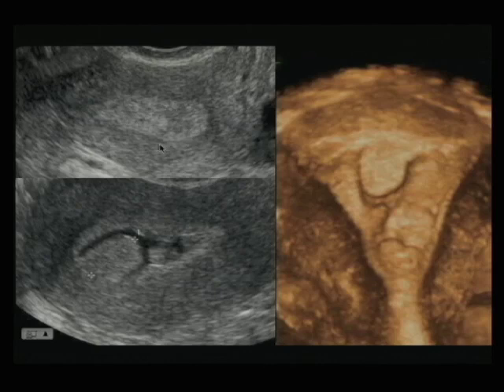So we really do need to introduce a little bit of fluid. The endometrium is definitely irregular here, but by introducing a little fluid, you can outline this rather large polyp and these other smaller polyps here. And then, if you want, you can render the surface, because you do have some fluid in there now, you can render the surface of these polyps and take a look at them as though you were doing a hysteroscopy. That's why we call it a virtual hysteroscopy.